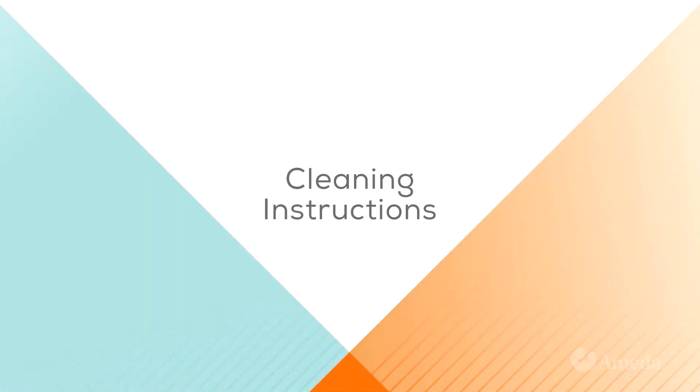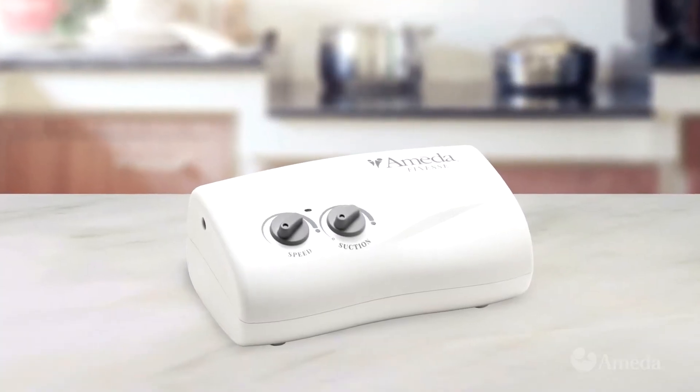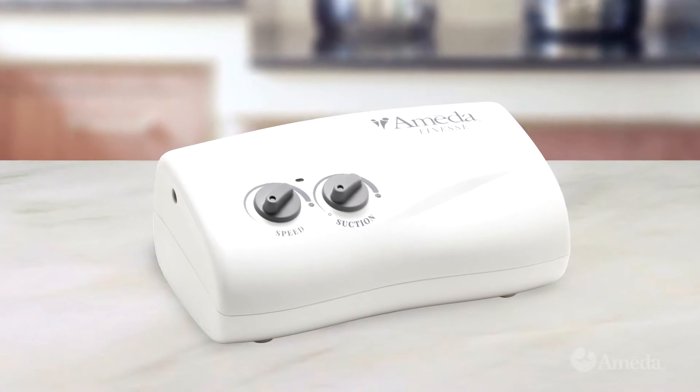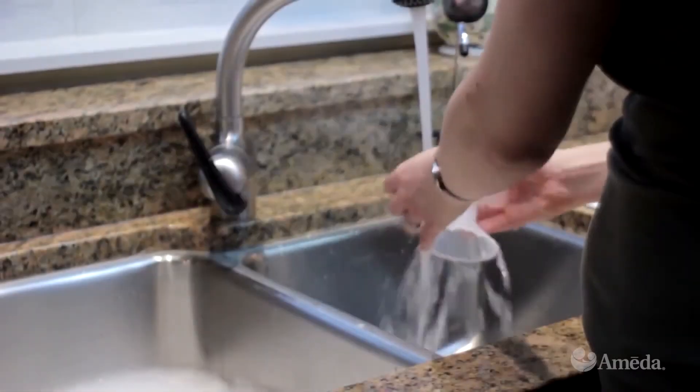After each use, clean the Finesse Breast Pump and the Hygiena Kit. To clean the pump, simply wipe the casing with a soft, damp cloth using only water or a mild soap.